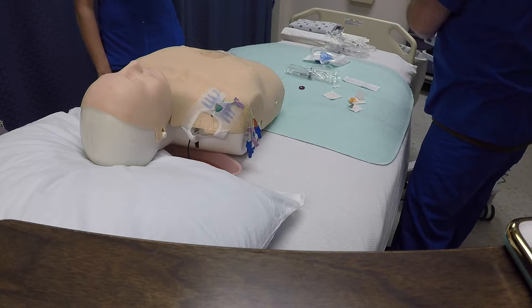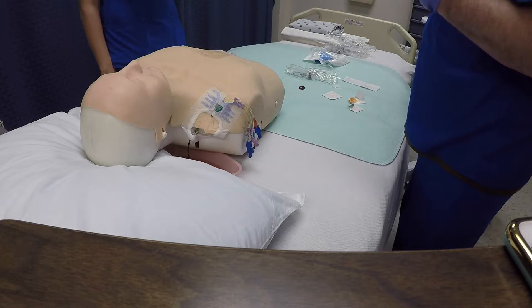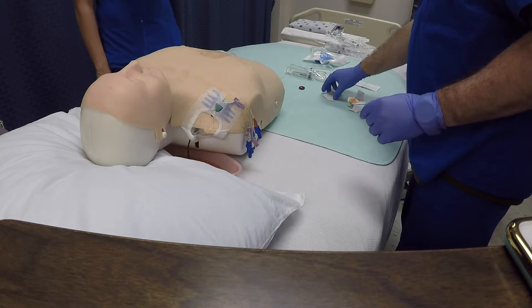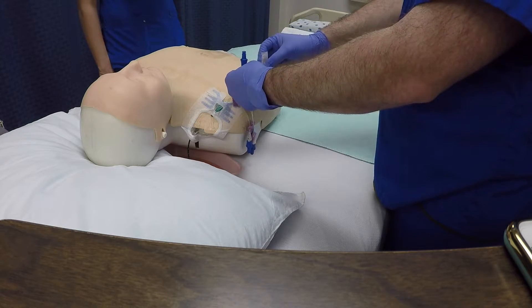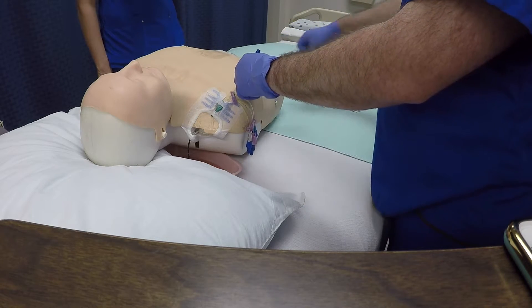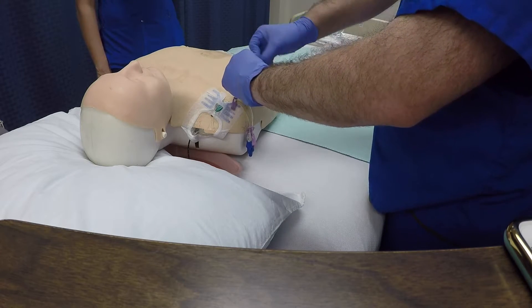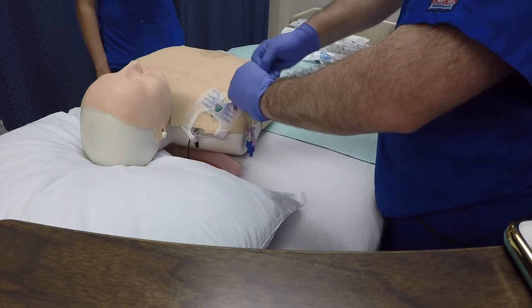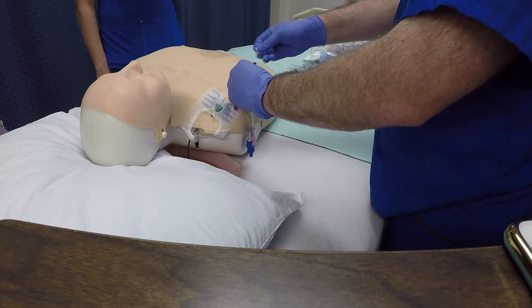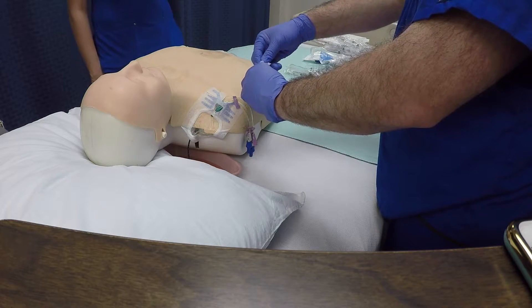Important step number two is to scrub the hub. There are two key points for that. Key point number one is to twist the hub ten times, and key point number two is to swipe ten times at the end of the cap.